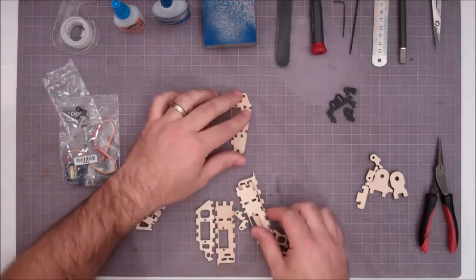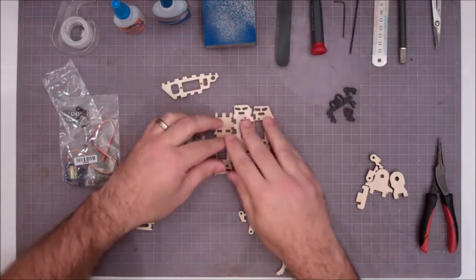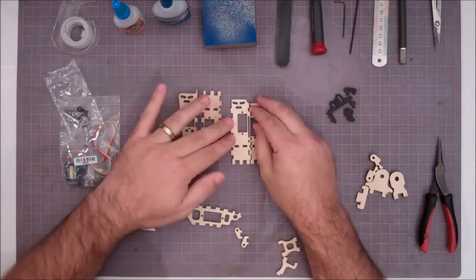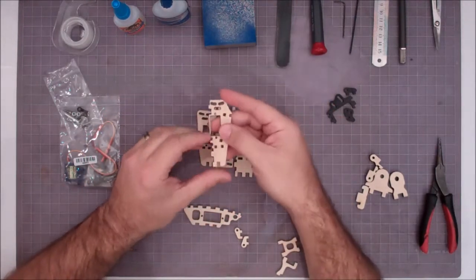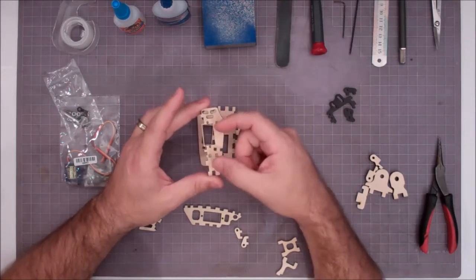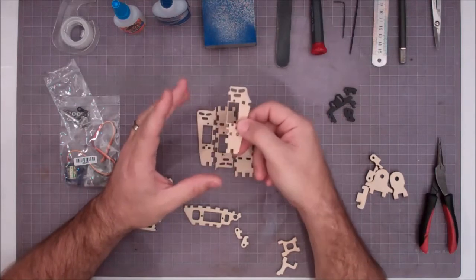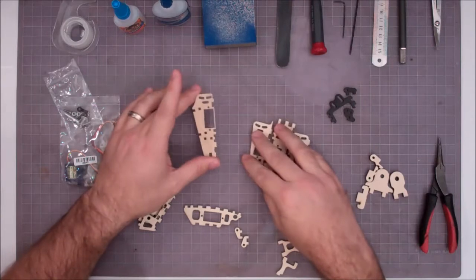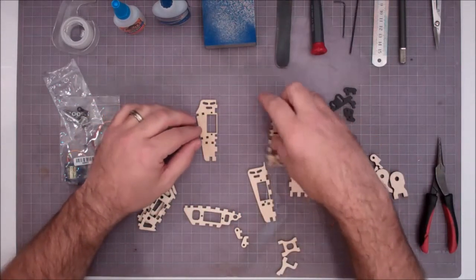First thing we're going to do is lay out all of our little palm plates. How we assemble these palm plates drives whether we're building a right or a left hand. If you find the one angled plate with the 2 notches in it, this plate is the thumb plate. This is what the thumb connects to. We start with this one. As I have been going along, I'm going to continue to build a right hand. So the thumb plate goes on the right. Now it's just a matter of finding the according plates that go with it.